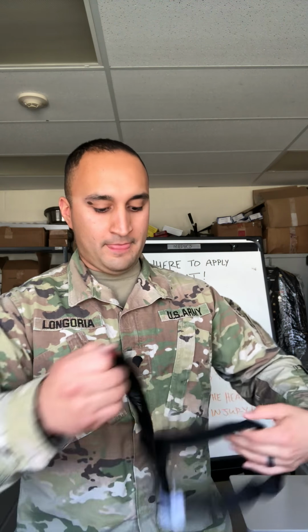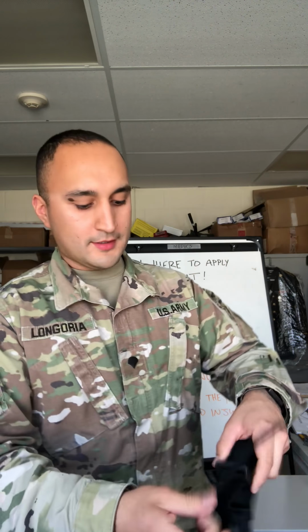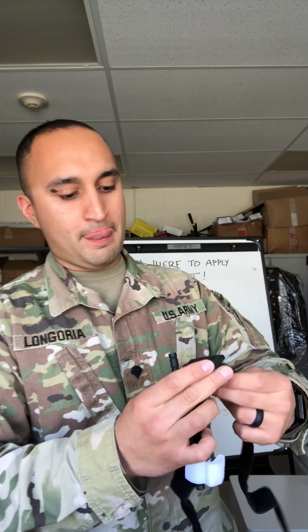How to use the CAT tourniquet? So, with the CAT, as I stated before, you have a friction adapter which holds it in place.